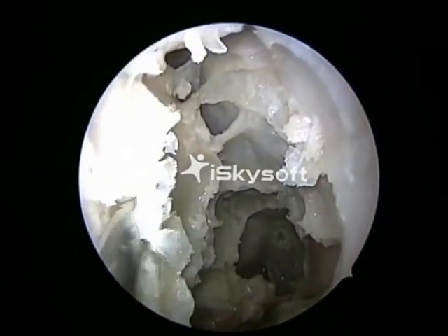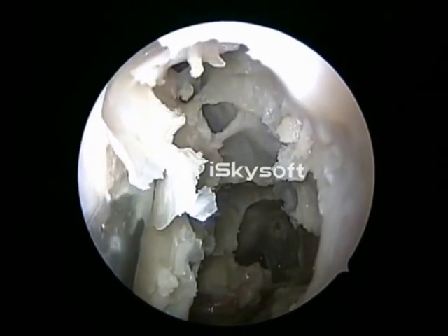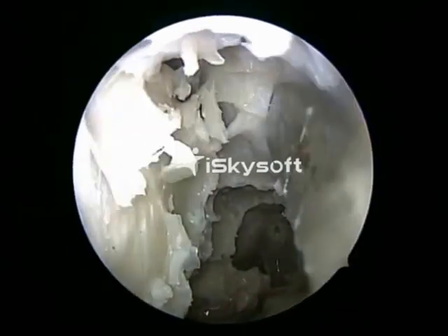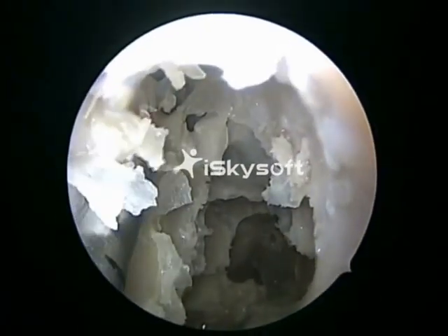The next exercise would be an orbital decompression, and for this we use a Freer's elevator to remove the lamina papyracea, and care is taken not to remove it above.